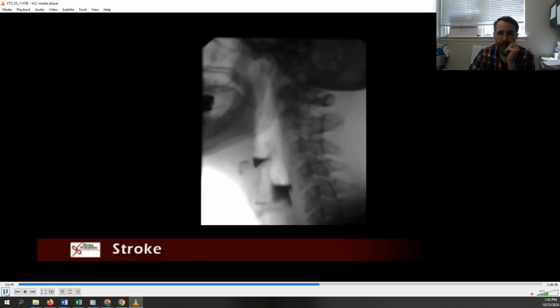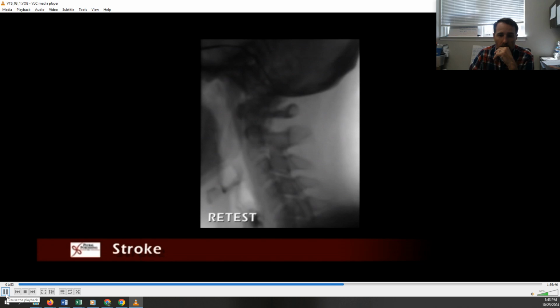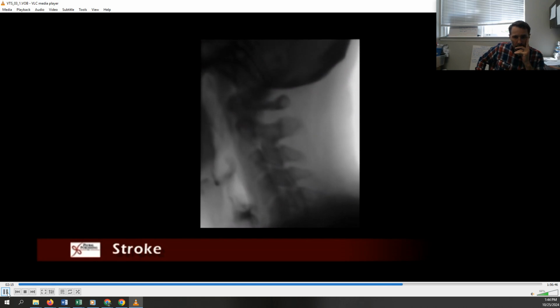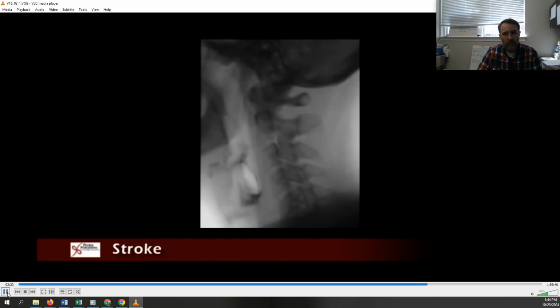A trace amount of liquid is noted to pass through the UES during a subsequent swallow attempt. Following a few weeks of therapy, the patient begins to demonstrate improved management of oropharyngeal secretions and begins to take food and liquid therapeutically. As he appears ready to support nutrition and hydration through oral intake, a video fluoroscopy of swallowing is performed to monitor progress and to rule out silent aspiration. The initial small presentations of thin liquid show advancement of the bolus to the piriforms with a more immediate initiation of the swallow and less struggle behavior.